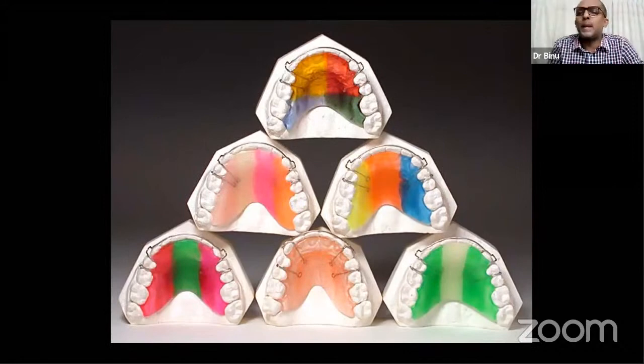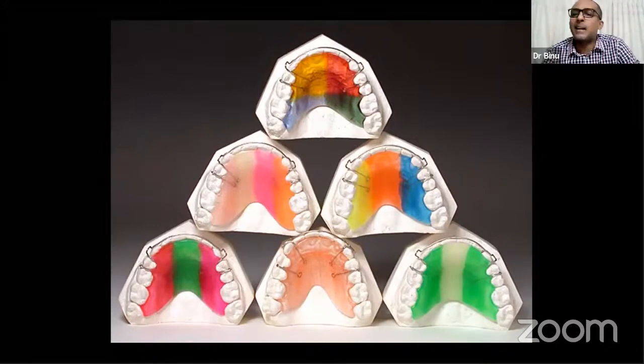Photograph a cast, I'm almost done. Why do you need a cast photograph? For recording purposes, patient orthodontic or whatever recording purposes. But if you want to take a picture of a cast, my suggestion is to always use white POP with a black background. You get nice contrast pictures, not that yellow POP, with yellow stone and green stone and all that for photography purposes. Try to use a white one with a black background, it gives good pictures.